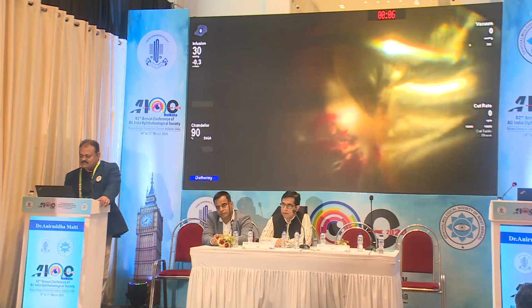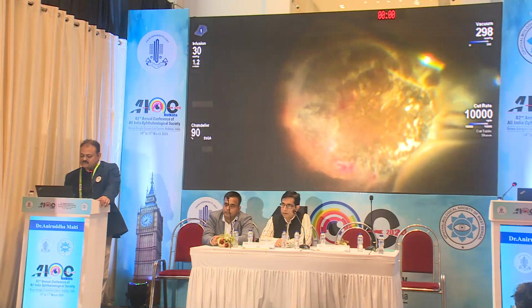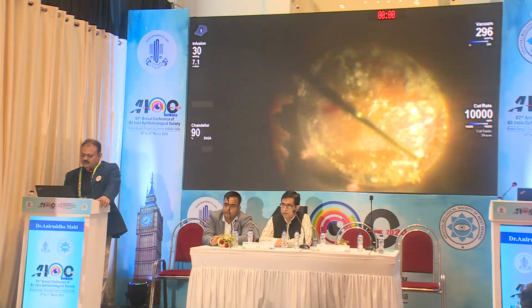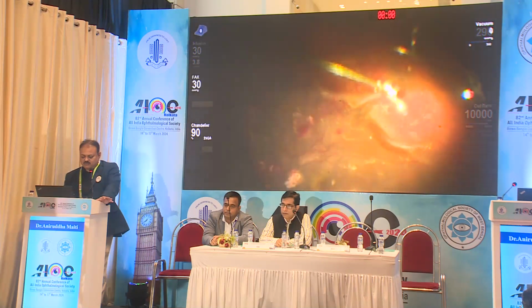mark the break. You can see once the membranes were released, the other part of the retina was quite full. So there was a big break. Same way you put the PFCL.